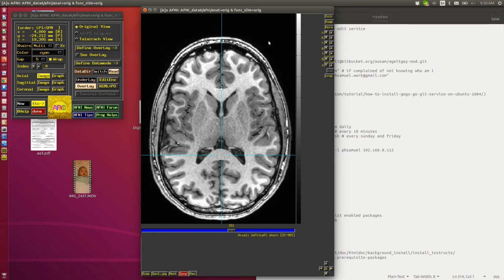Now, we work with a guy named John Buttman, who's a radiologist I really admire at the NIH, and he was saying that in radiological systems they don't have films anymore usually, it's all computers, right? And I said, oh, to change the contrast and brightness, you don't have buttons.